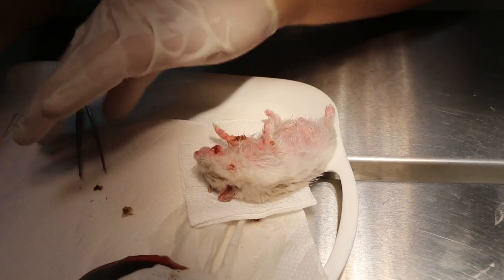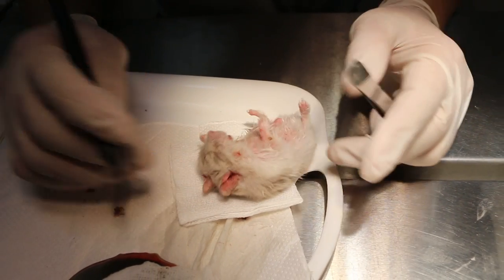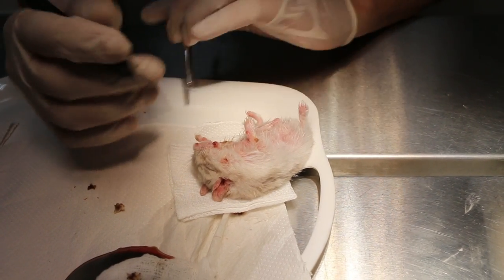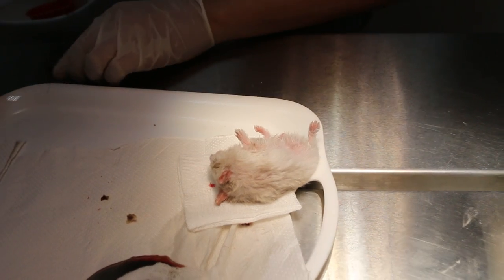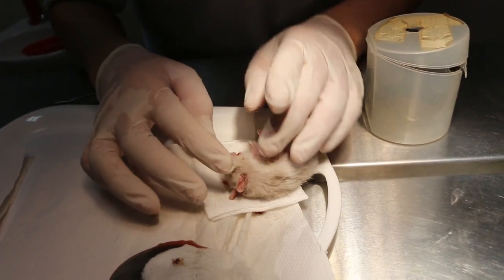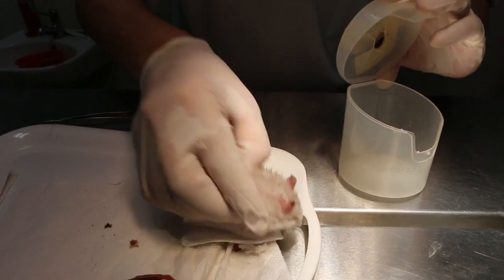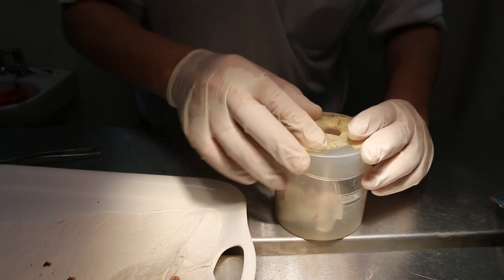Then now, let's check for any more warts. Now this one is not a wart, this is an abscess. This was a wart here. There's a limit, since the whole place is inflamed. So I will just conclude the surgery and anaesthesia. Okay, finish. Right.